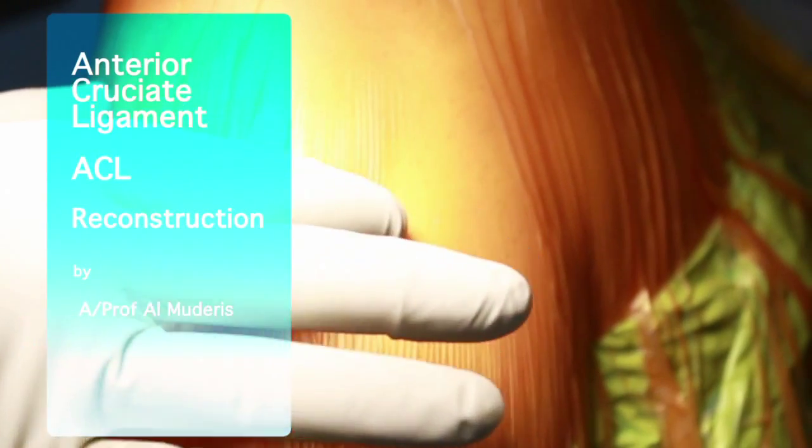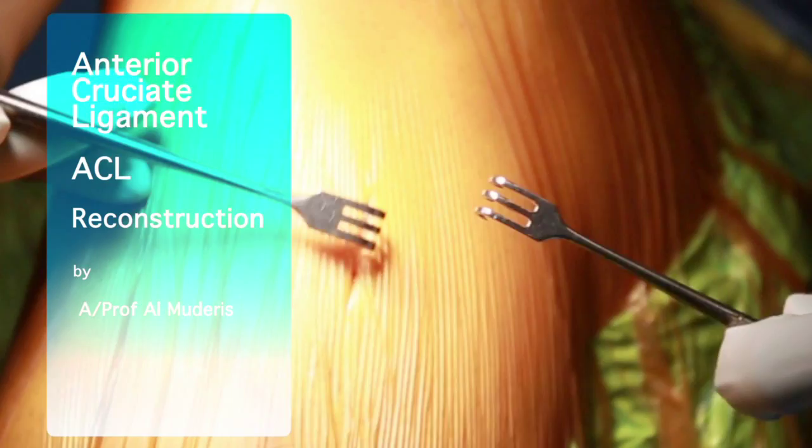This is a video presentation of an anterior cruciate ligament reconstruction performed by Associate Professor Almadieris.